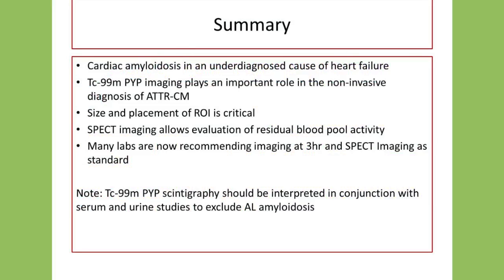So kind of in summary, I know I threw a lot of information at you in a short period of time. It's understanding the disease process, understanding the difference between the symptoms with AL and the ATTR, and how those can present differently in the nuclear cardiology lab will help more streamline and result in better diagnosis of these patients who present for otherwise unknown cause of heart failure.